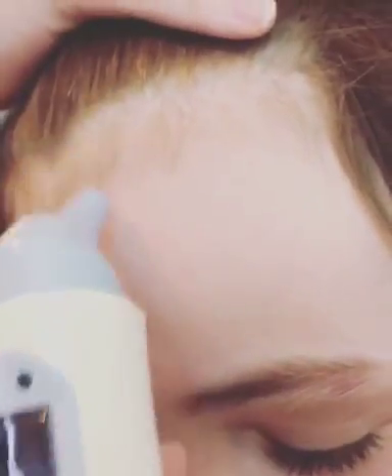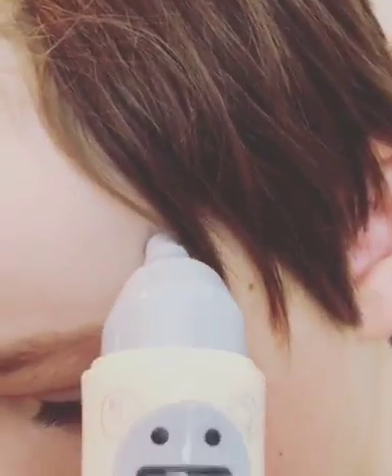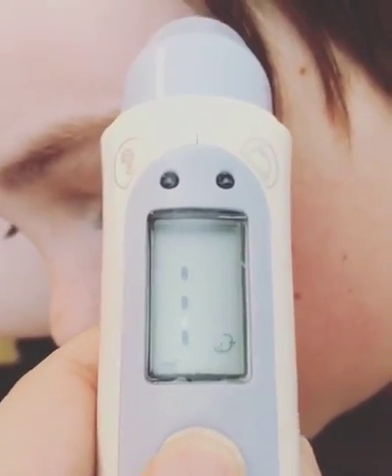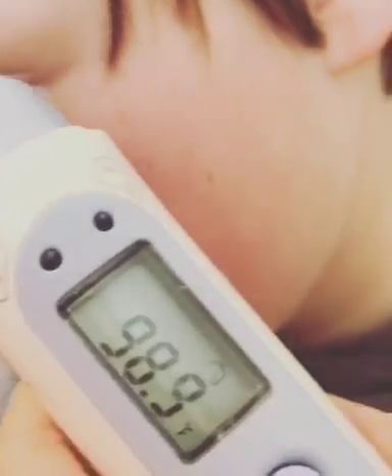Okay, you gotta hold the button. Whoops — put it in the middle of the forehead, and then move the skin to the temple, and then hold on, pull it off, and let go. So you're 98. And then you also have ear mode.